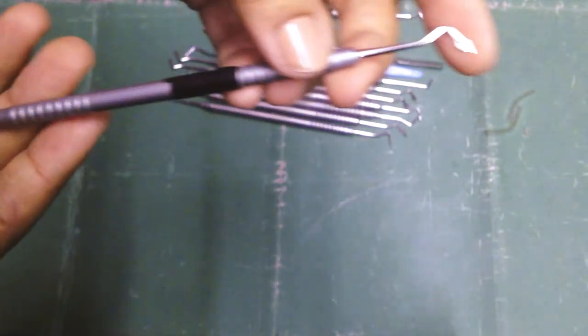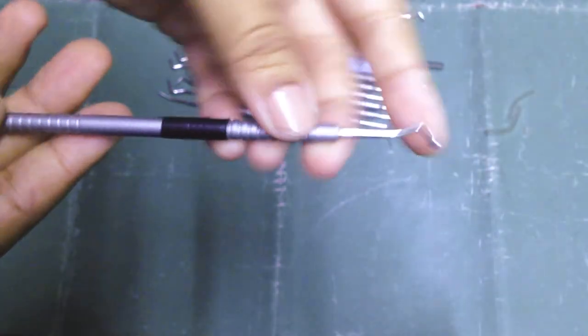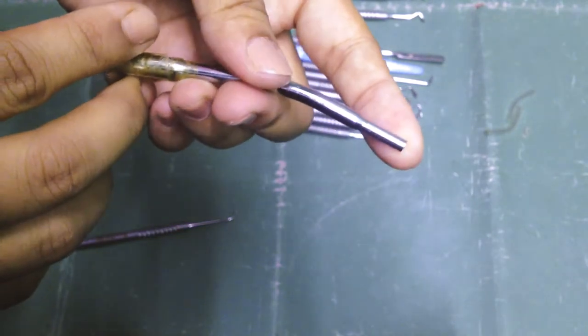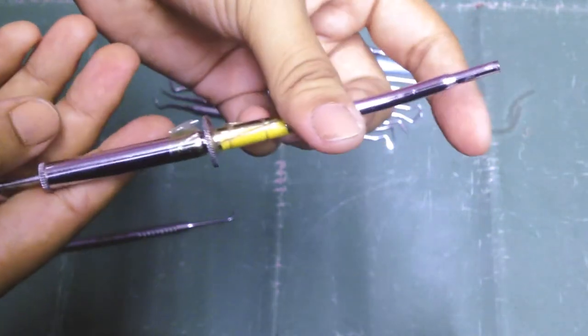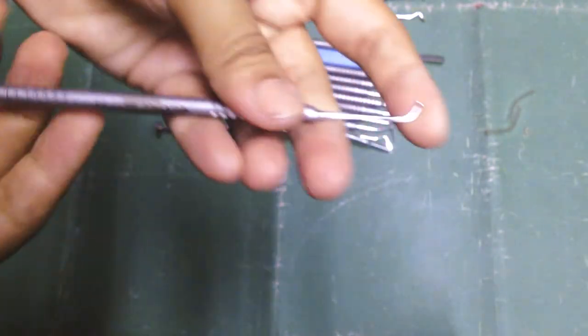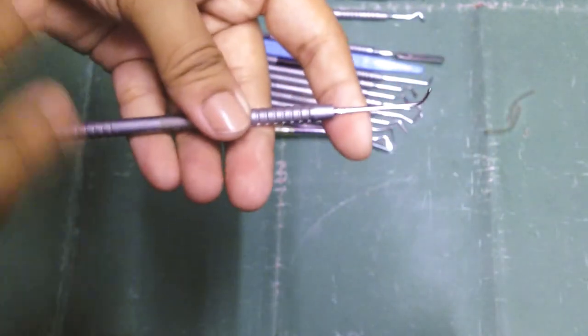Then this is a diamond-shaped carver. We have an amalgam carrier that I absolutely forgot. This is an amalgam carrier. Then we have a burnisher. This particular one is a ball burnisher.